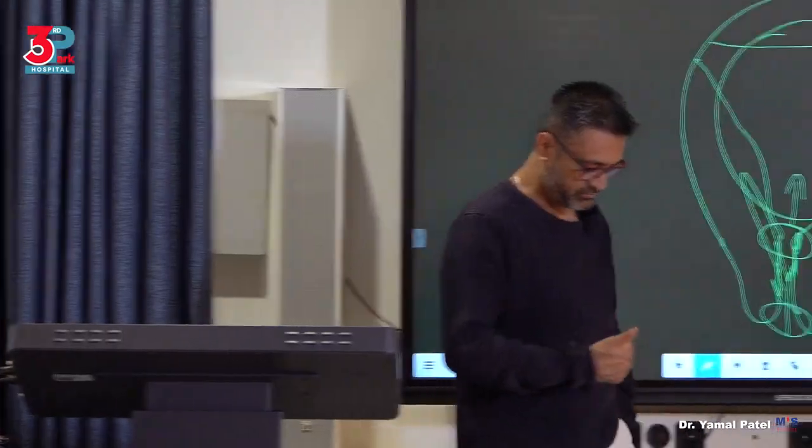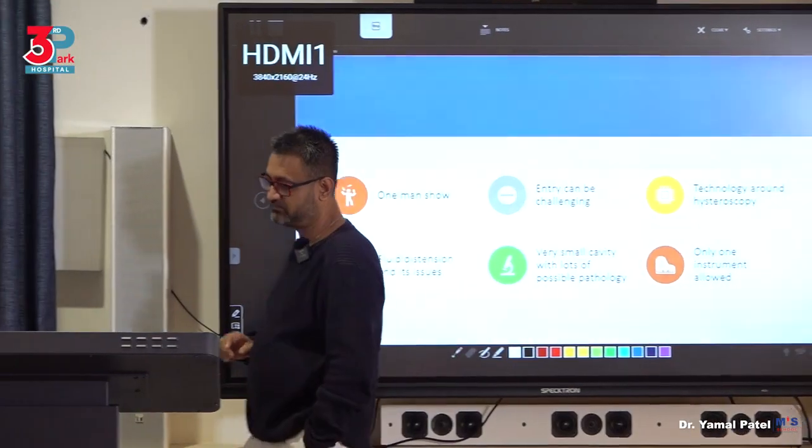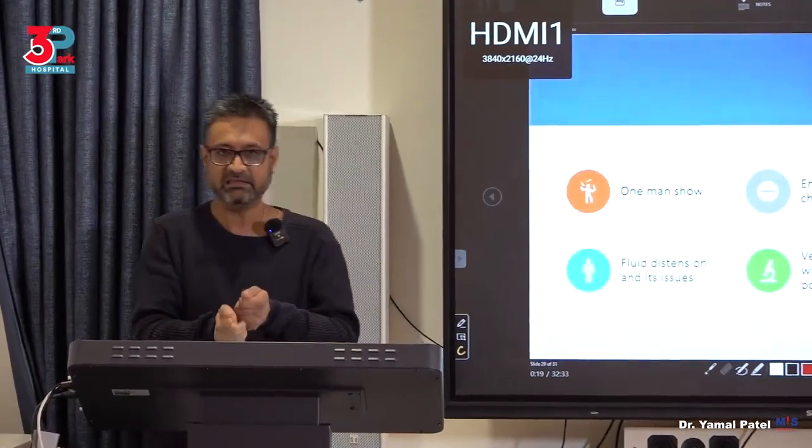So what do you need to understand about hysteroscopy? Number one, hysteroscopy is a one-man show. Okay? So hysteroscopy is a one-man show. What does that mean? In hysteroscopy, my dear, the surgeon is the one who is holding the camera and operating. There is no assistant helping him.